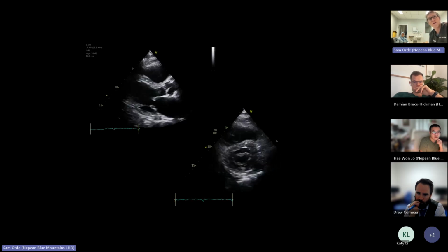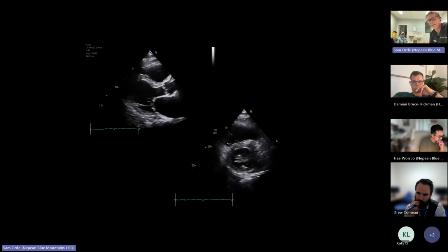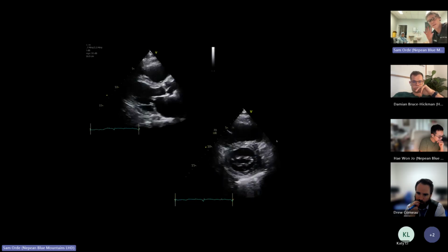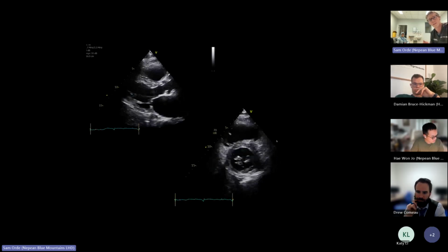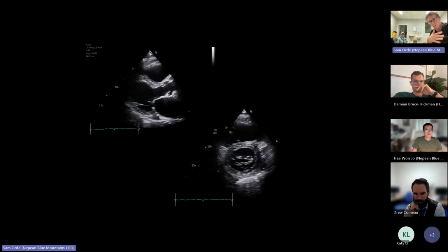Beautiful. So it's not mild to moderately impaired. It's not low normal. It's not, slightly okay or something. So again, for the DDU, let's get our language precise. I think sonographers can get away with saying it's mild to moderate, but as reporting doctors, and I think when we're talking to each other, it's important to make a call. And that's what advanced echo is all about. So you've got to say it's mild, moderate, or severe, or normal.